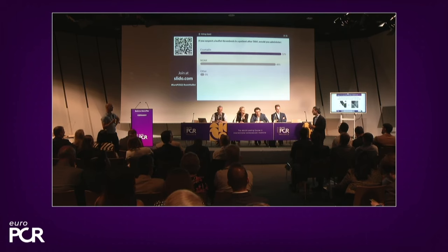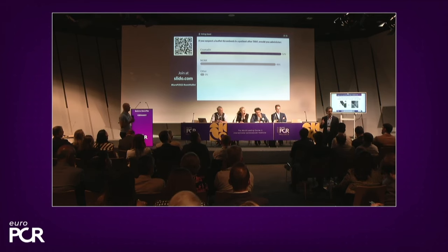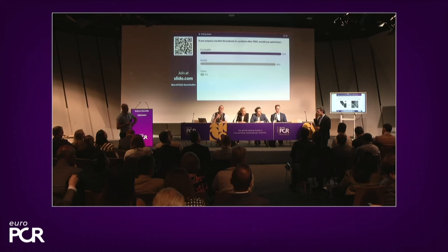But Sabine, really, I was blown away by your PET scan. This is probably going to be the one thing that I leave this PCR with, saying, wow, that is mind-boggling. What you've demonstrated is that it looked good on the CT scan, it looked good on the echo, but there was still something going on on the PET and you continued the anticoagulation. Whether it's right or wrong, I don't know, but it's so interesting.